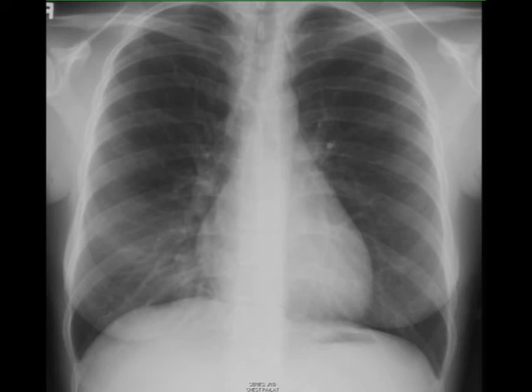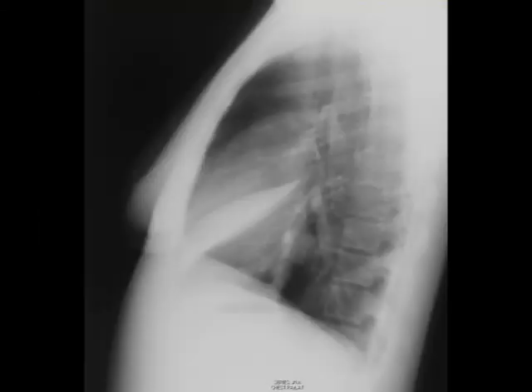On the lateral view it becomes very obvious what's causing this — this is right middle lobe atelectasis, much easier to see on a lateral film, where you can see the right middle lobe atelectasis overlying the heart. It's very subtle on the frontal view.